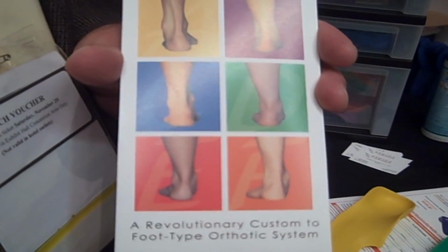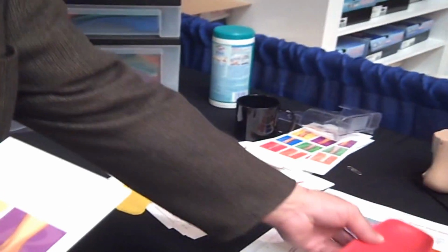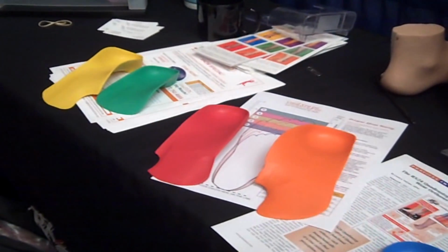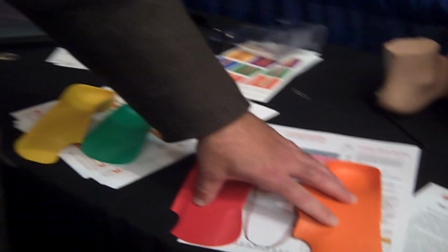At that point, I don't have to decide E or F. I can go to my system and based on their shoe size, I can grab both of those orthotics out of my kit. Now it's like selecting someone's custom orthotic, which one is going to fit and function best. So it's like selecting 2 pair of custom orthotics out of my closet, and I forgot to put names on them, and one of those 2 orthotics is going to fit my patient.